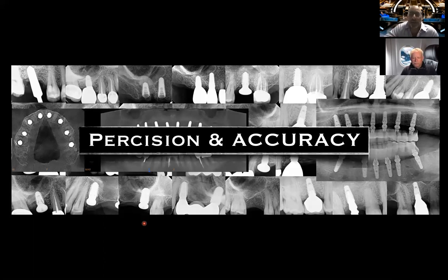Sometimes that may be a static guide, and sometimes that may be free-handed for all that matters, because the patient needs an implant that day, and you don't necessarily have a navigation system. And other times it's going to be using virtual navigation. I would say that most of my implants are being placed by navigation, and I hope in the near future I'm going to be placing all my implants under navigation, not just the 75% or so that I'm doing now, as we keep expanding upon these and even finalize more protocols for some of these full arch cases.